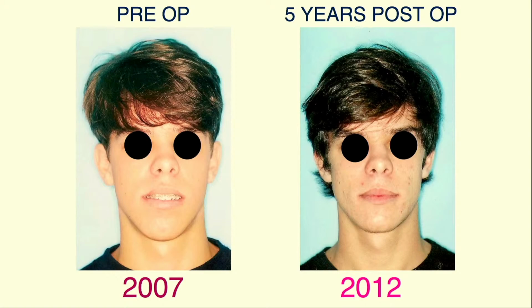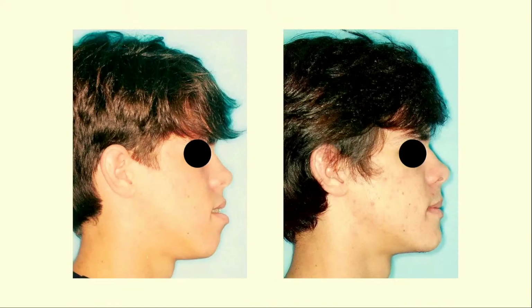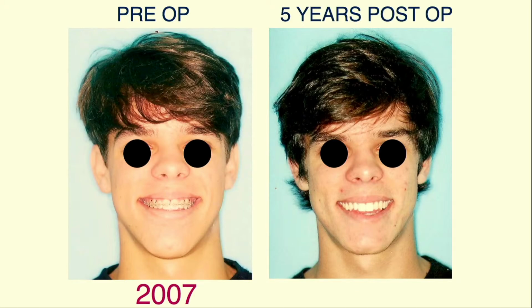This is an old case, 2012. We had a 5-year follow-up. And we can see here the occlusion at the beginning after orthodontic preparation, the occlusion after the surgery, and 5 years post-surgery, showing the stability of the case. In a very short surgery, just mandible and chin, about 2-3 hours, the patient had good stability and a good result. So all these steps we have to follow and to see before and to decide before. I need to have all the definitions before the surgery, before the treatment.